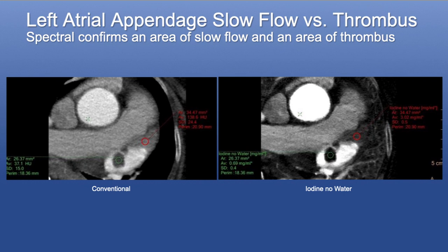So moving to, I think, another important part for dual energy CT, is in patients that are being imaged for left atrial appendage imaging. So this could be cases where there's a workup for a CVA. This could be cases where the patient is going to be cardioverted, or this could be cases where we're doing the scan for a pulmonary vein ablation. Here, Luigi DiBiase keeps us very busy with the ablations. We do a lot, so we do a lot of scanning before ablations.